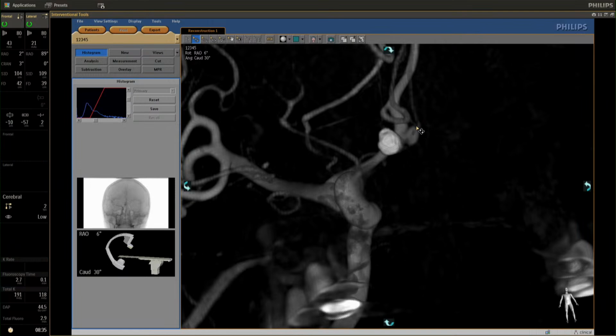We will see after placing the balloon. Maybe we will do a compression test again, and we'll see the segment. If there is a risk of occlusion of contralateral ACA, then we will place just a flow diverter Silk Vista Baby. We will see.